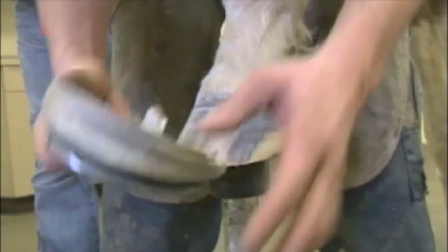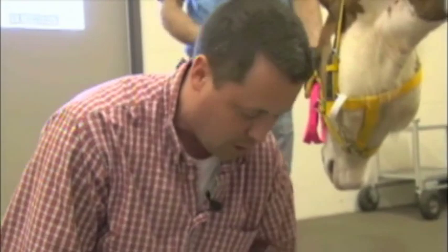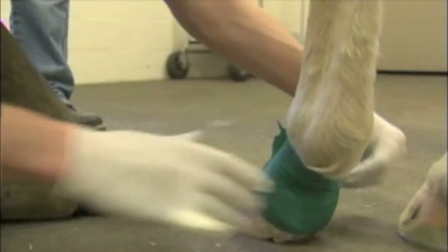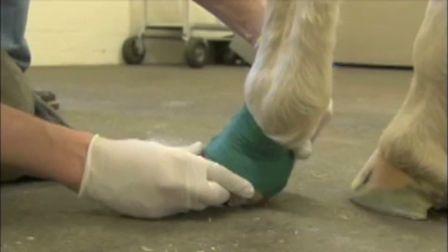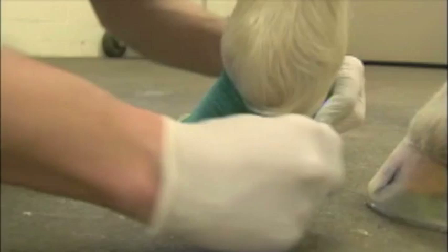We're going to glue this shoe on - glue this cuff just to the outer surface of the foot. It'll be a little different technique than what we saw on the direct gluing method. Since we're going to be putting a lot of glue on the exterior surface of the hoof wall, we're going to wrap the coronary band up first so we don't get any glue on the hair and on the coronary band. I'll use some vet wrap, roll it up until I just see the hair, and then take some white adhesive tape - just enough to cover up the hairline and the coronary band.